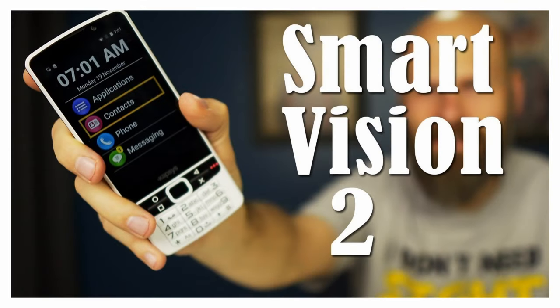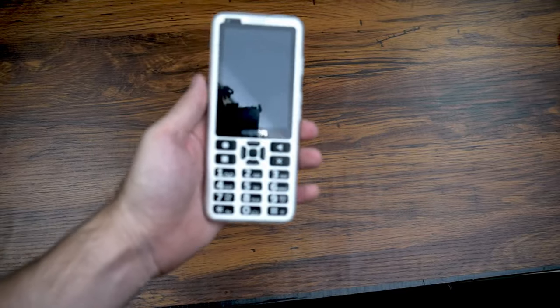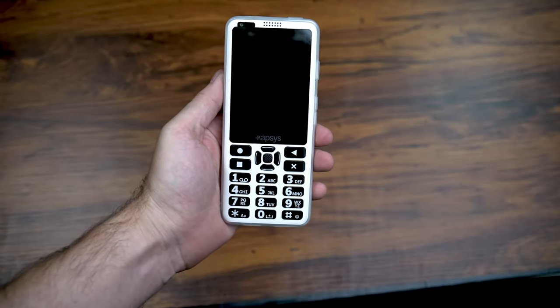A few years ago I did a review of the SmartVision 2, and although you can't get that phone anymore, I still get questions all the time from people asking how to get their hands on it. Well, the SmartVision line of phones is back with a new and improved version — this is the SmartVision 3, and it is definitely an improvement over the previous model.